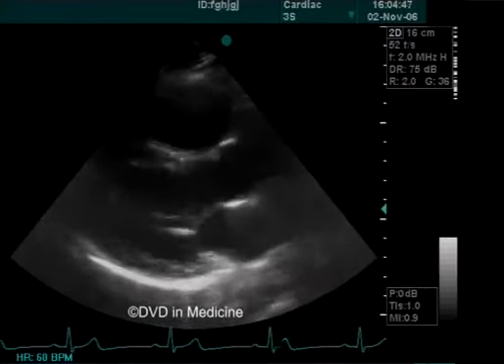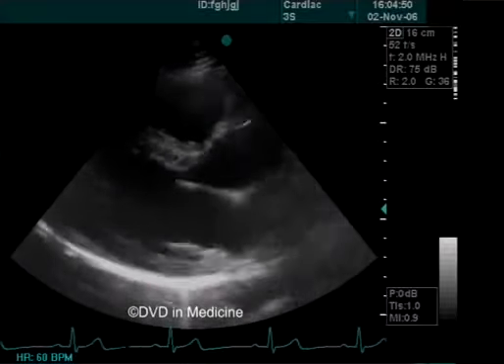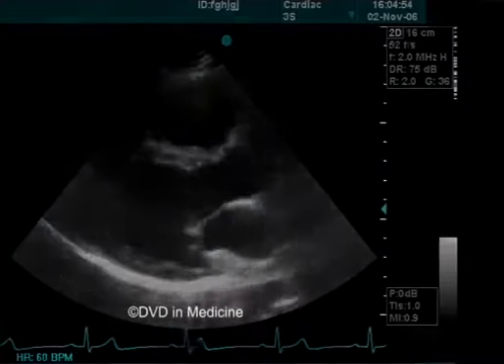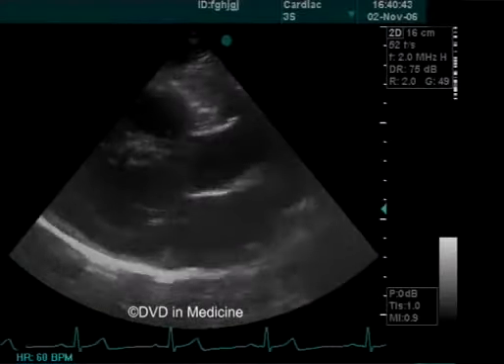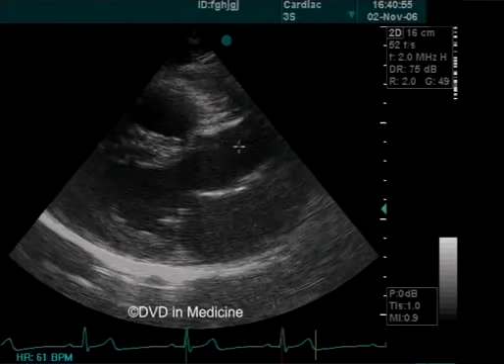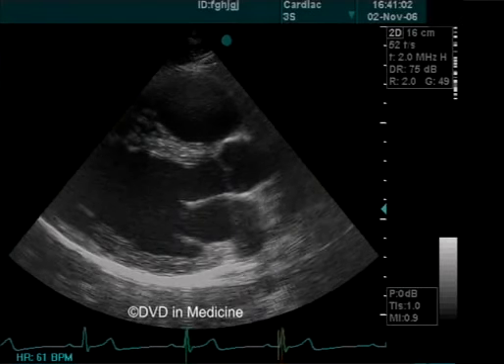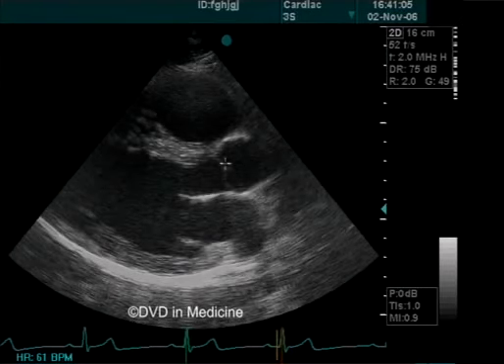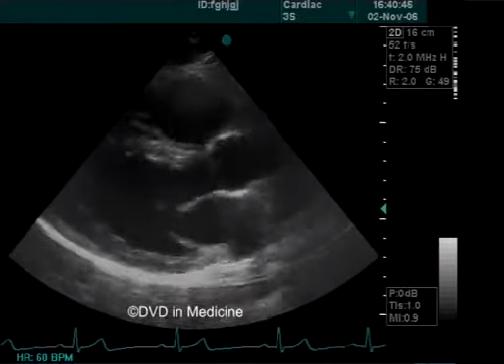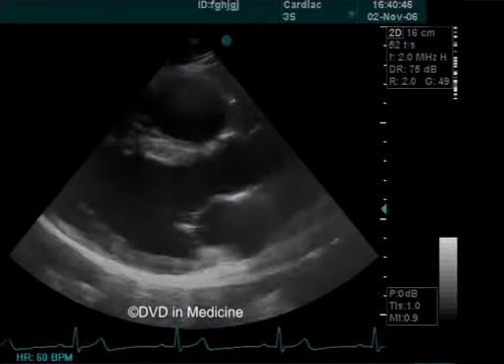plane has been angled. In most cases, one cannot clearly discern the motion of the aortic valve leaflets because they are very thin. In systole, the aortic valve leaflets are seen as two parallel short strips which are positioned adjacent to the aortic walls. In diastole, one will see the leaflets at the point where they close, in the center of the aortic root. One can see the aortic valve leaflets more clearly when they are thickened or in a very slim patient when there is a proper acoustic window.